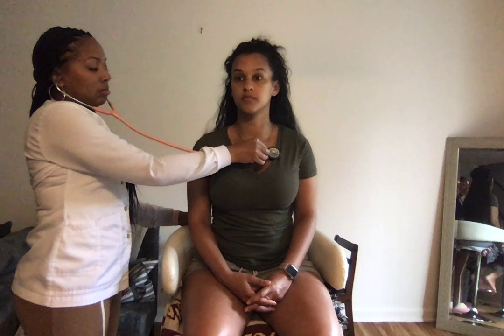Now I will use the bell of the stethoscope, which is used for lower pitch sounds of S3 and S4, as well as to detect murmurs for mitral stenosis. Aortic valve, right upper sternum border, 2nd intercostal space. Pulmonic valve, left upper sternum border, 2nd intercostal space.